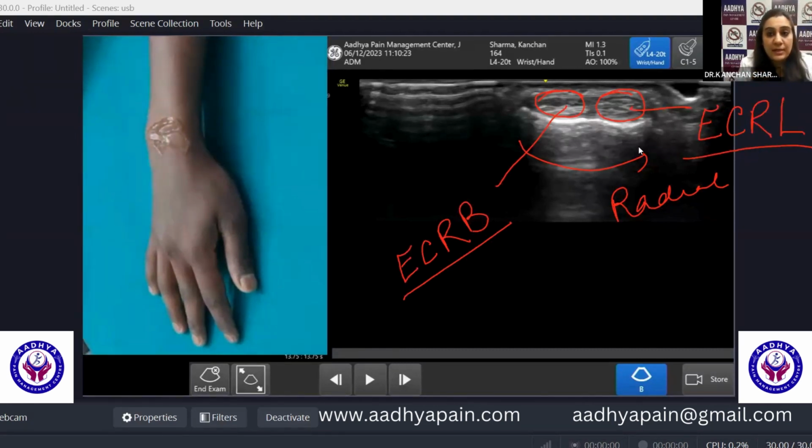So ECRB and ECRL: the moment you have moved from the Lister tubercle and you are sliding your probe towards the radial side, you will be able to see two tendons. These are the tendons of the second compartment. The one lying closer to the Lister tubercle is your ECRB, and the other one is your ECRL. So these two tendons are the tendons of the second compartment.